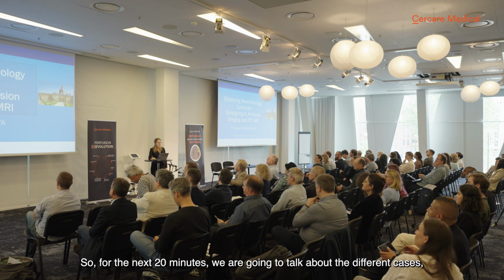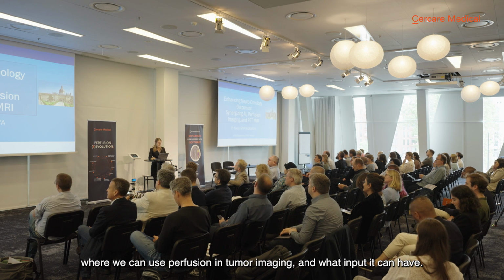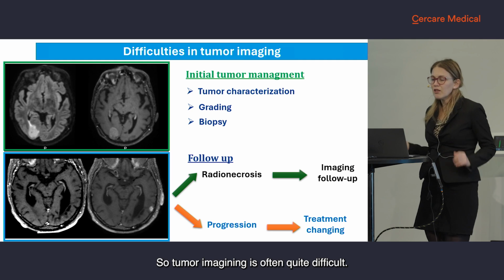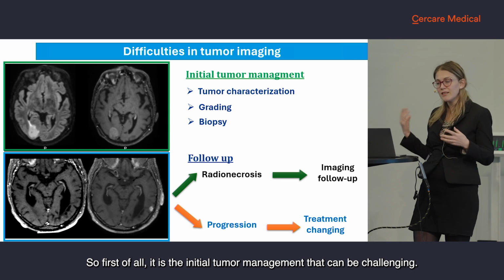Okay, so we are going to talk for the next 20 minutes about the different cases where we can use perfusion in tumor imaging and what input we can have. Tumor imaging is something quite difficult. First of all, there is the initial tumor management that can be challenging.